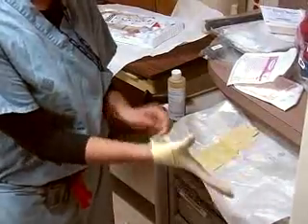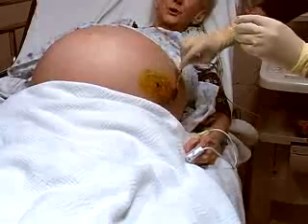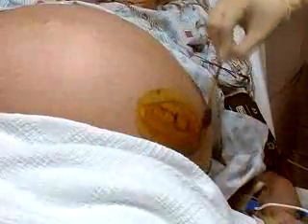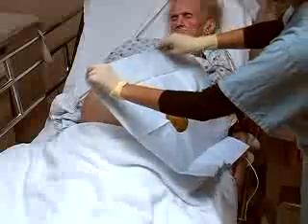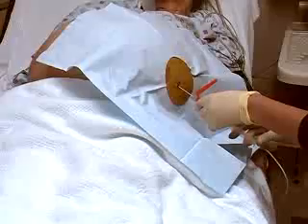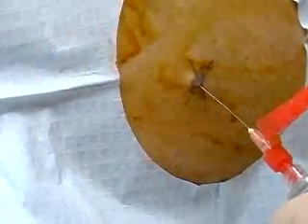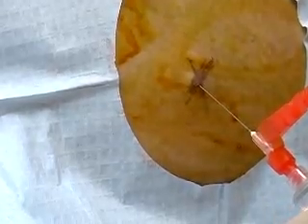Next, put on sterile gloves and begin to prepare the entry site with either chlorhexidine or povidone iodine. Use gradually increasing concentric circles during antiseptic application and apply a sterile fenestrated drape once you are finished. Using a 25-gauge needle, place a wheal of 1% lidocaine in the superficial tissues overlying the entry site.